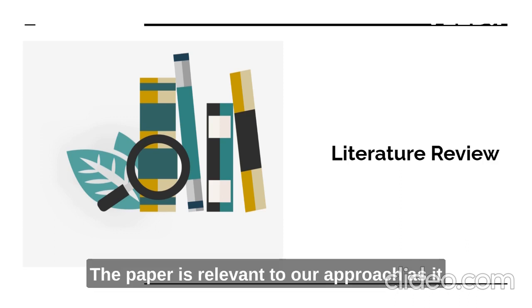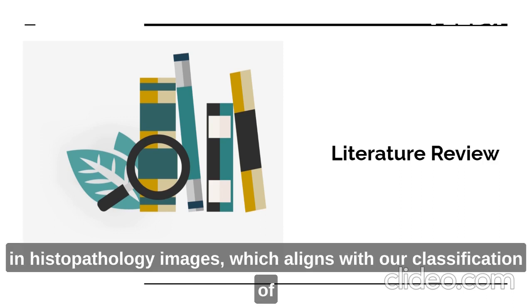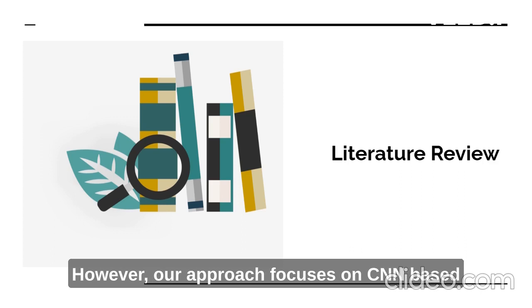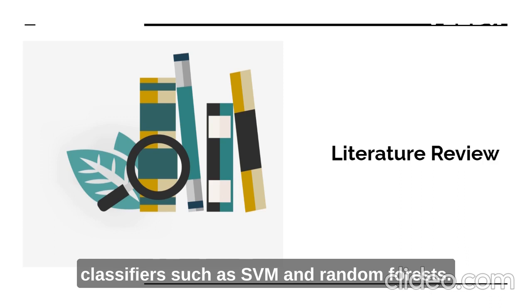The paper is relevant to our approach as it discusses a novel approach for detecting and classifying nuclei in histopathology images, which aligns with our classification of histological images explored in our approach. However, our approach focuses on CNN-based methods, while Paper 1 suggests exploring alternative classifiers such as SVM and random forests.